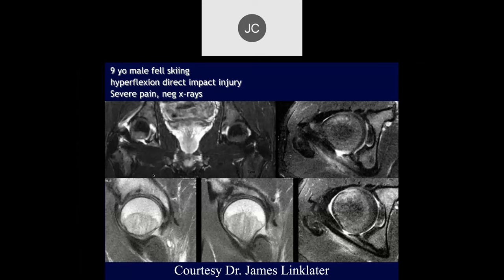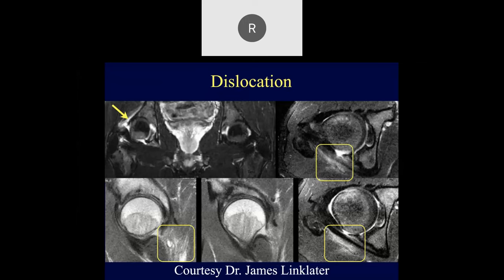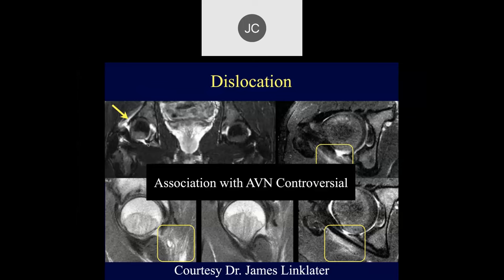Nine-year-old male who fell skiing, hyperflexion direct impact injury, severe pain, negative x-rays. Looking at the ischiofemoral ligament, there's some increased signal, maybe some discontinuity, and some adjacent edema. This patient was dislocated and had a tear of the ligament from the dislocation. There's debate about whether these dislocations are highly associated with AVN, but some may be associated with femoral head fractures not well seen on plain radiographs but visible on MR.